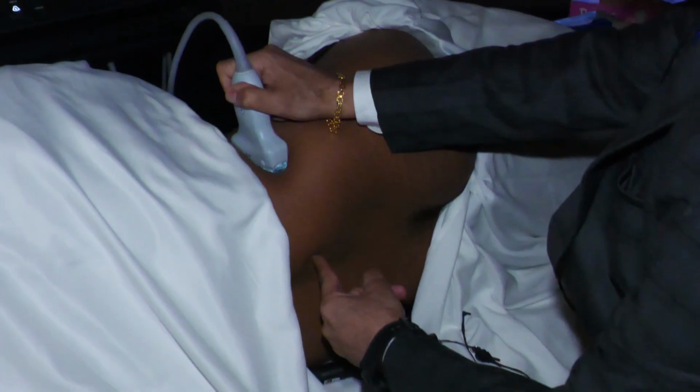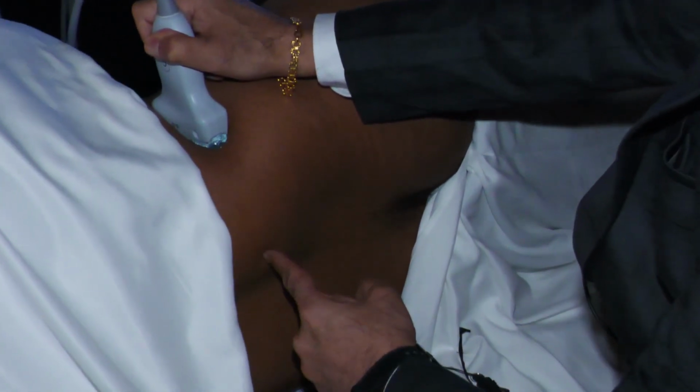Yes. So I'll measure 8 centimeters from this place and enter. Or alternatively, I can enter from this place. Okay. So, but this will be quite an oblique trajectory. So once again, we'll go back to the image.